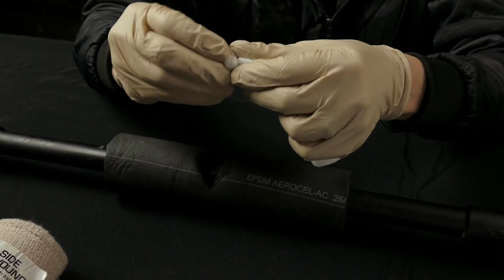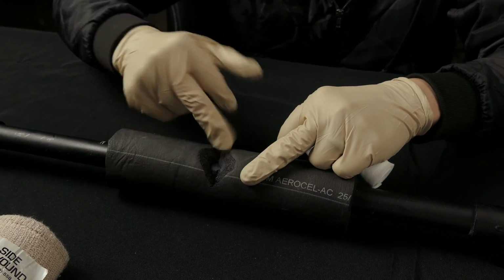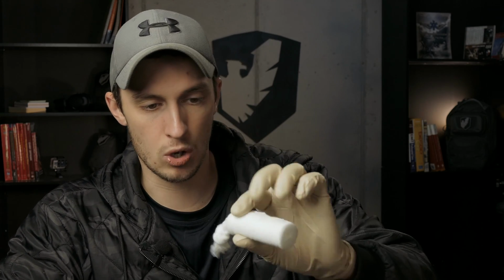So look in the wound, I'm gonna sweep some of this out, find where the pressure is, apply a gloved finger directly to that area, and I'm putting hard, firm pressure on that area. Now I'm gonna take my gauze, which I'm gonna use a roll here for demonstration purposes. I'm gonna pull the end out, and I've tied a little bit of a knot in the end. That just gives a little more substance directly on that first point of contact with that artery.